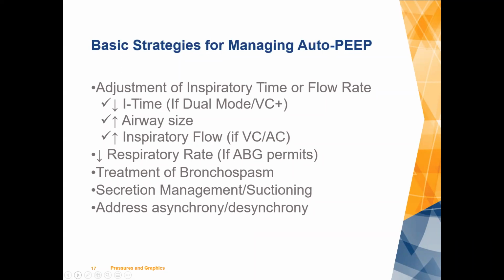Treat the bronchospasm, suction the patient, address any asynchrony or desynchrony issues. Sometimes it's just that patients come up from the ED and they're not adequately sedated, and they're breathing over the vent, and it's not the setting, it's that the patient needs to be quieted down. They need to be initially sedated, and I'm not one for sedating our patients until the end of time.